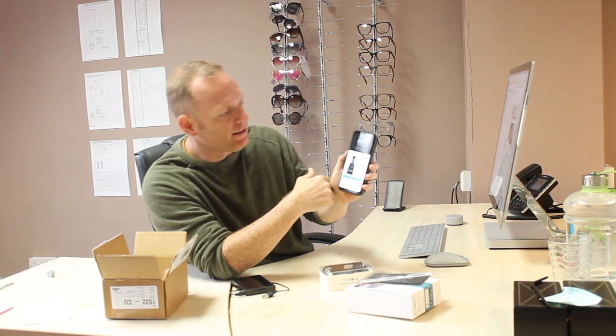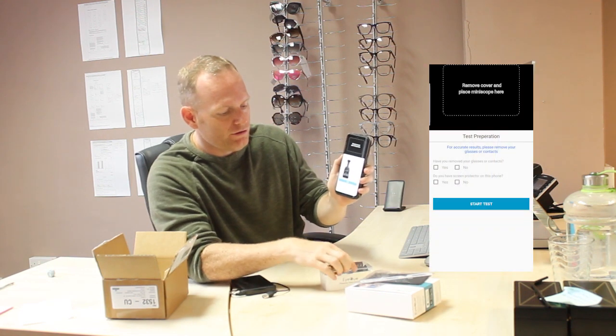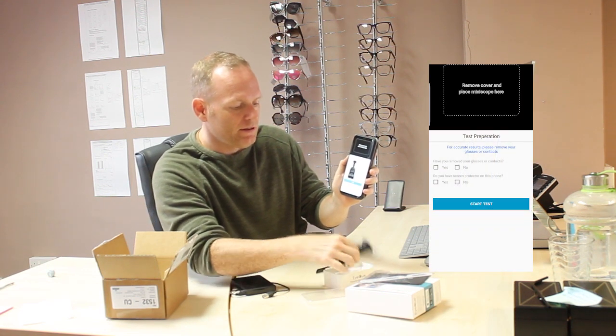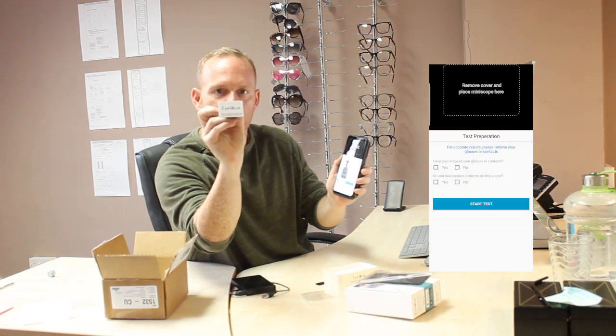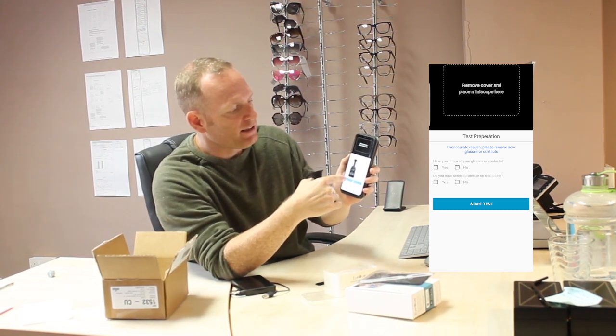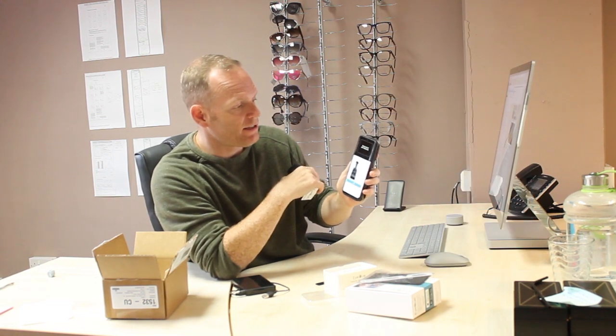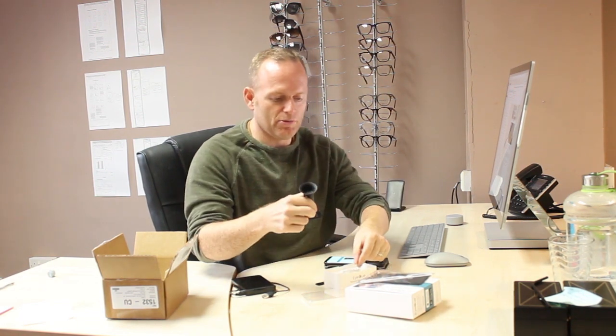So we've done all the tutorial and practice. I'm going to press Test again, and as you can see it tells you to remove the cover on the scope. There's the iCube cover — so I'm going to remove that, attach it to the box, click next, and then it's going to guide us through the test. It sticks on and keeps that part of the scope clean. Let's attach that to the box.